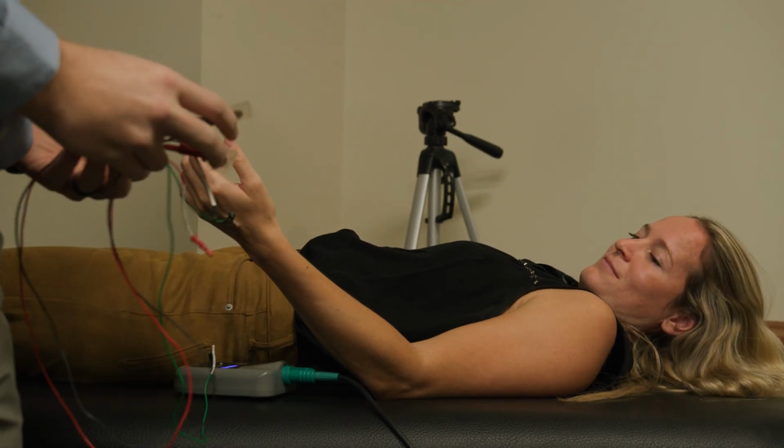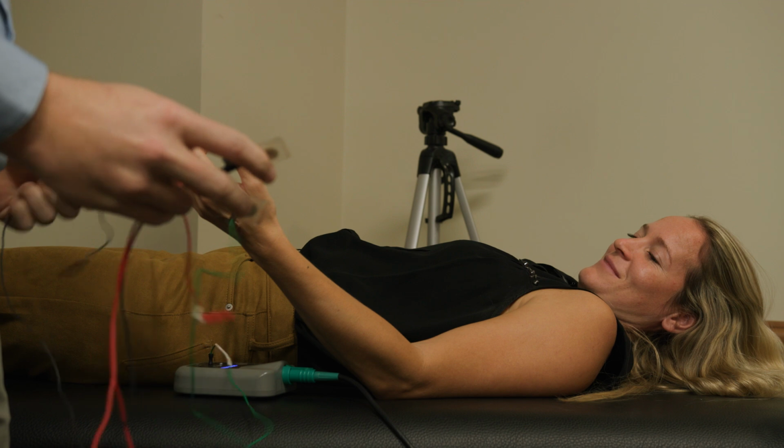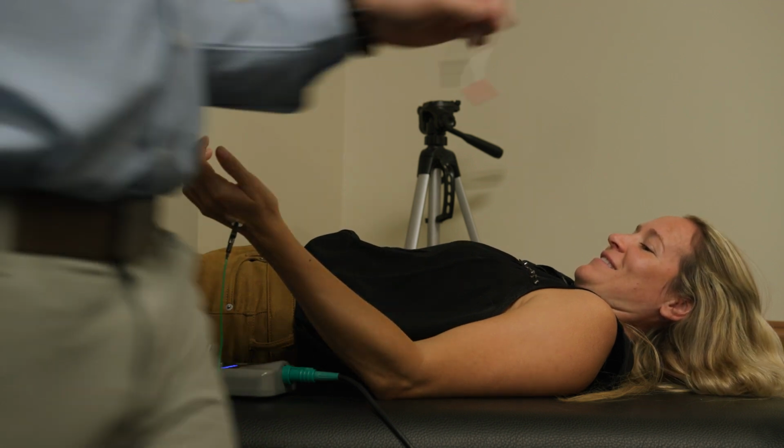This is the hardest part of the test for me, not tangling all the wires. That's what Spencer comes in for, right? Yep.